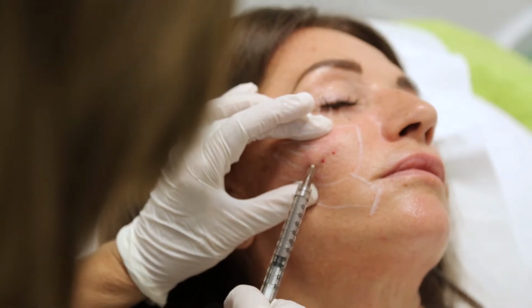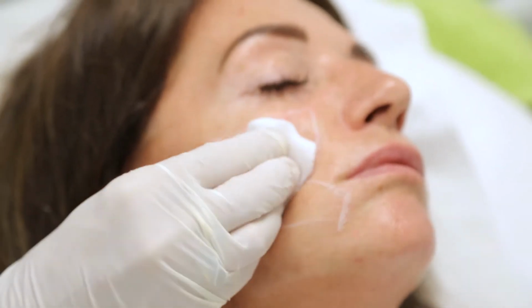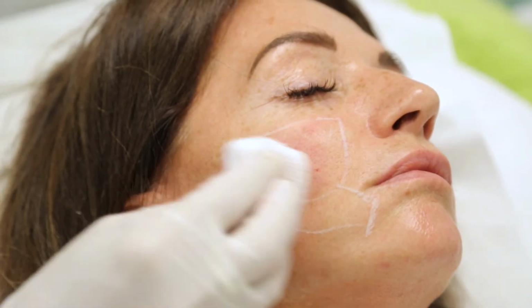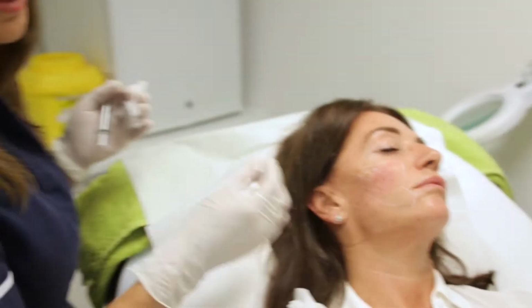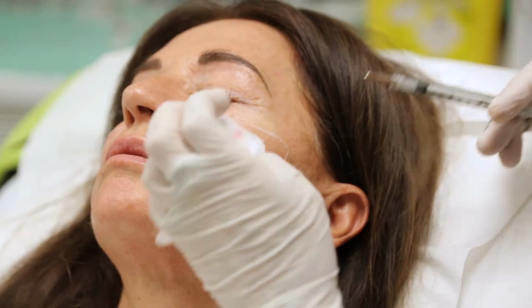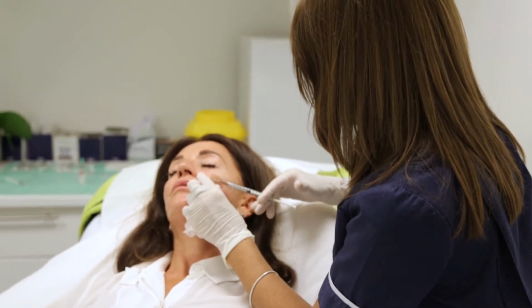And you can see it's actually what we call a deep tissue filler. Although it's a lot of injections in this area, certain areas will bleed probably a bit more than others, but it does settle pretty quick. The injection marks will settle within a couple of days. So I'm going to concentrate on this side a little bit more than the other because this, to me, needed more volume in this area.